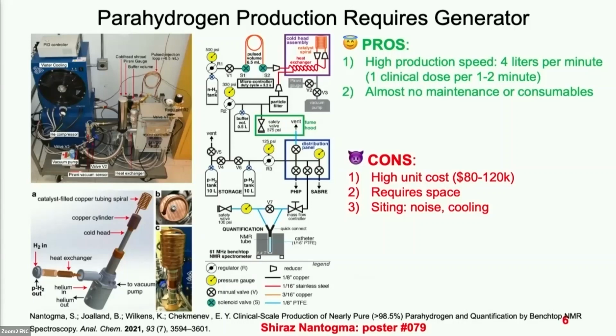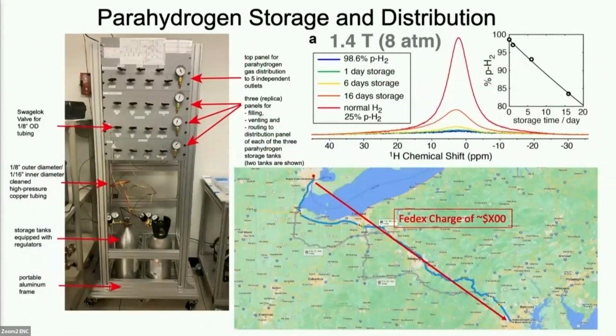On the other side, we need to remember that this device costs quite a bit of money, so this is not exactly low-cost technology. From that perspective, it requires siting space, even for this semi-portable device on wheels. There are certain siting requirements from the perspective of noise and cooling requirements, so it's not exactly a fun device to have.